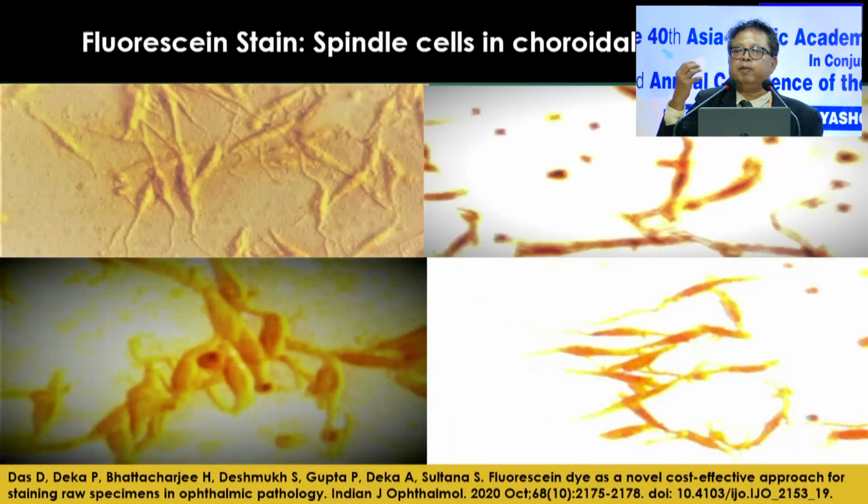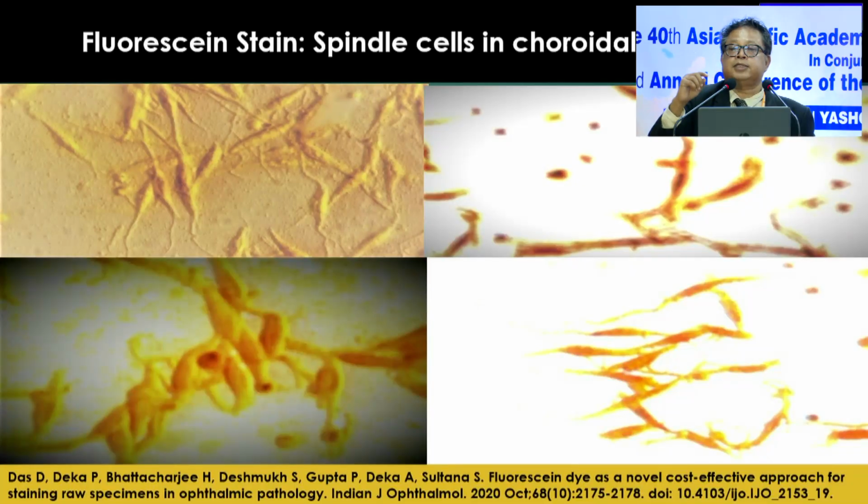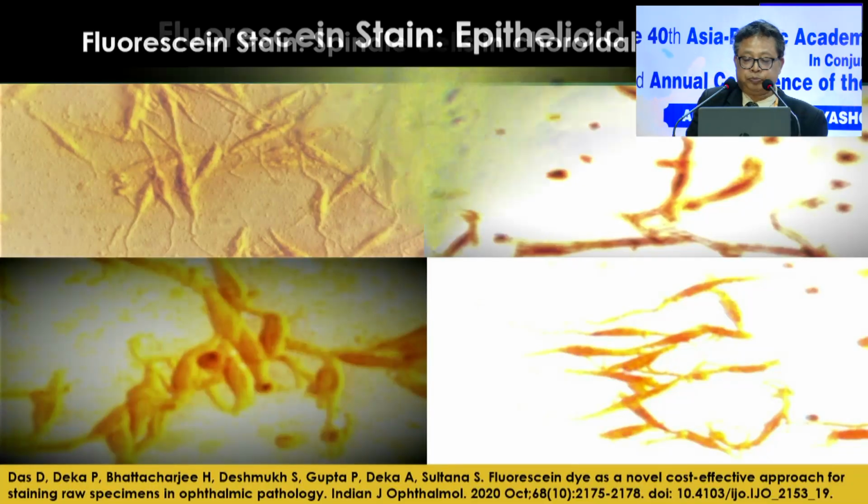You can make a number of preparations, including a fluorescent stain. If cells come in the vitreous cavity, in real-time fluorescence, even in a live patient with the 90D, we may be able to see this type of cells in the vitreous cavity one day.